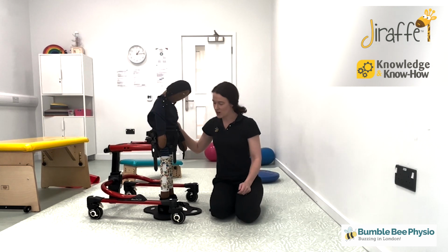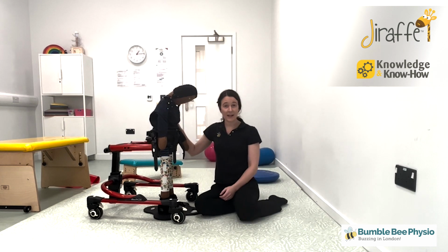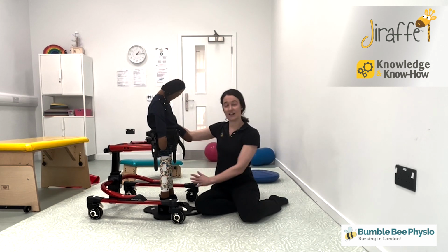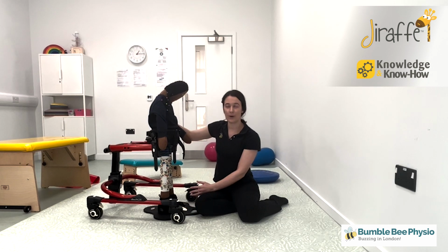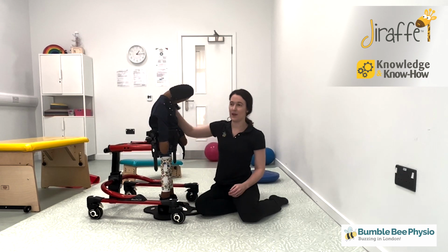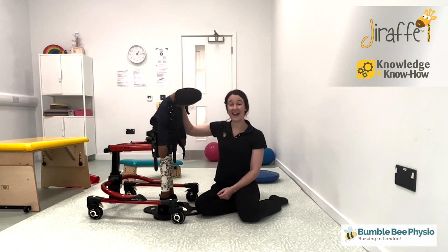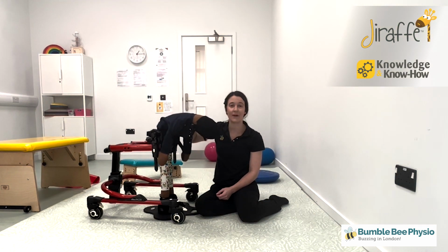Now, if it's a knee contracture, we're going to have to think about the gaiters. If it's a little bit, maybe we're talking less than 15 degrees, we might be able to put gaiters on. And actually, just standing like this with a pair of gaiters on, with heels flat on the floor or in their AFOs, might be a hamstring stretch enough for them. In children who don't have a knee contracture and they've only got a reduced popliteal angle, then we can actually add some more onto that stretch by encouraging bending forwards and down as well.